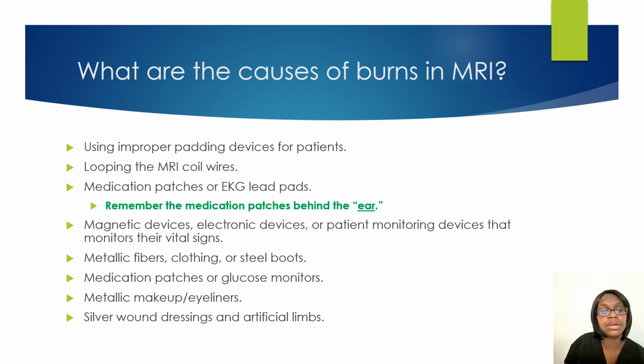Remember to check the ear. Check behind the ear for medication patches. All the time I've seen patients have them behind the ear. I remove all medication patches. I don't care if it's a nicotine patch. I don't care if it's an anxiety patch.